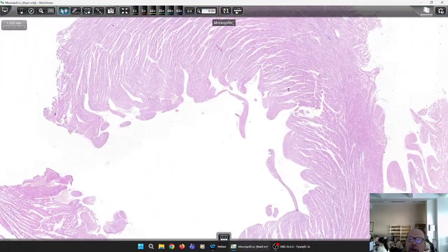And here, what can this be? Here, perhaps we are close to the valves, and this could be, you remember the papillary muscles, the papillary muscles, probably here, I'm not sure, but they look like.